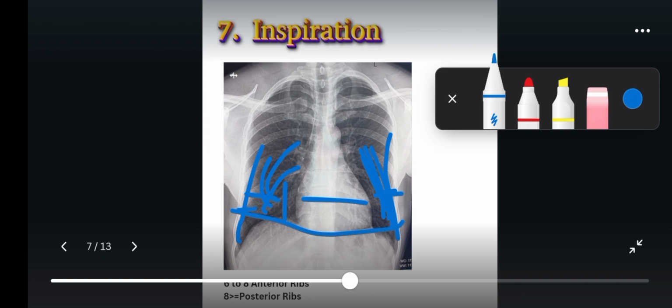It will be misleading. And the structures that appear crowded can equally mimic pathology. If there is a level of crowdedness, they can appear like a density that can signify infection like pneumonia. If they are crowded, it may look like the lung markings are prominent, and that can signify CCF, and this will lead us to misdiagnosis.